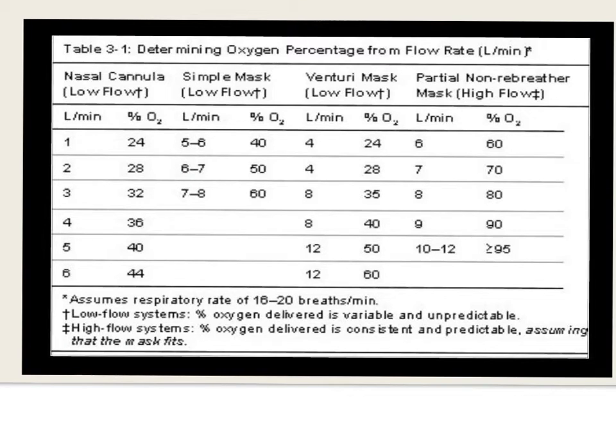Okay, I think this might be a good slide that you guys could cut out and put in maybe your clinical tablet or clinical notebook. It tells us about the different delivery systems. So you guys should know, for instance, that room air is 21%. So anything above room air, or 21%, is considered oxygen therapy. So for instance, here's the nasal cannula. Some literature says it goes up only to 5, some says 6, but certainly not more than 6. So you cannot give more than 6 liters of oxygen via a nasal cannula.